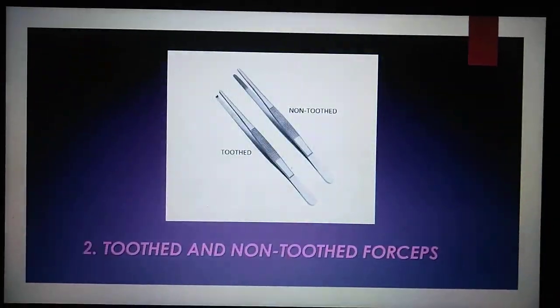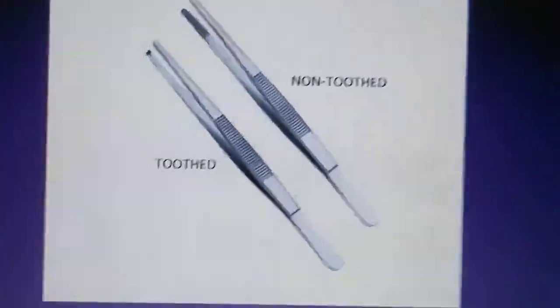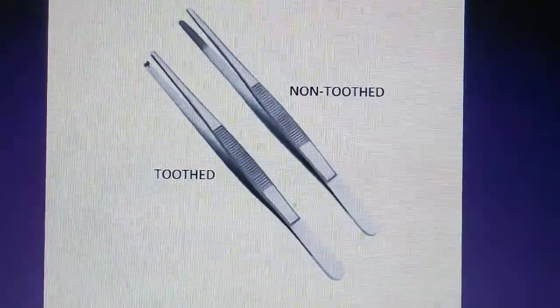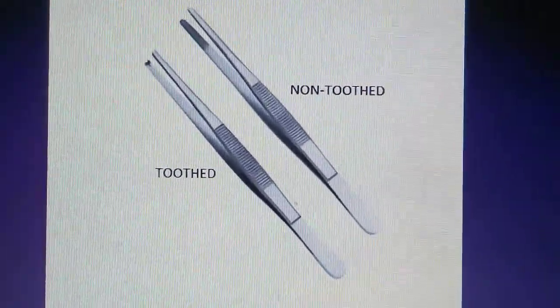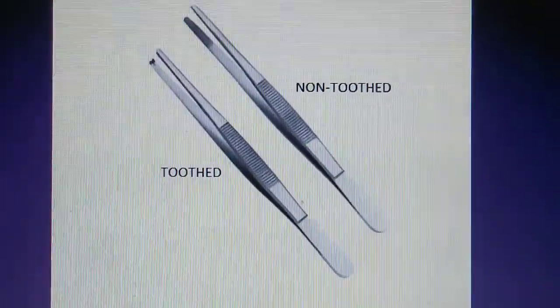The second one is the toothed and non-toothed forceps. The non-toothed forcep is for fine handling of tissues and traction during dissection. The toothed one is for handling dense tissues, such as during closure and manipulating of the needle.